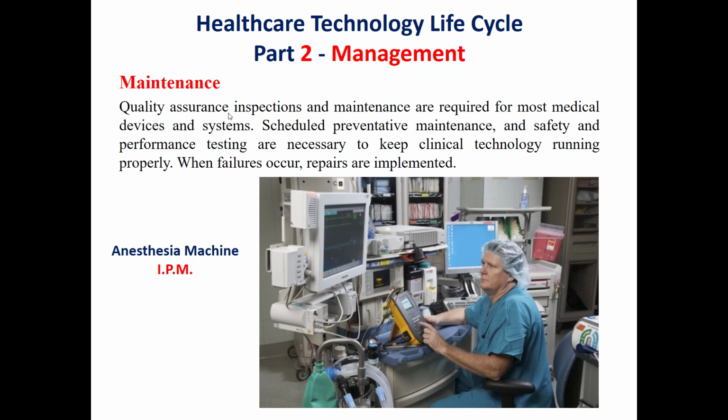We have the preventive maintenance, which is done in a periodic way, for example, every year or every 6 months, depending, as we said before, on the risk of the device. But currently we are moving to another type of maintenance, which is called predictive maintenance.